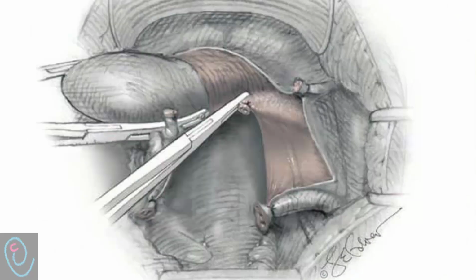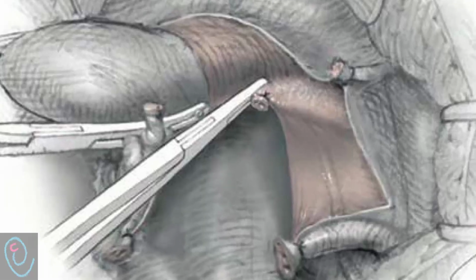Cardinal and uterosacral ligament transection. These ligaments are present lateral to the uterus and inferior to the uterine vessels. A straight clamp is positioned across the cardinal ligament, adjacent to the cervix, and medial to the uterine artery pedicle. A scalpel then transects the portion of the cardinal ligaments medial to the clamp. Ideally, the surgeon cuts close to the uterus. Then a transfixing stitch is placed below the clamp, and the clamp is removed as the knot is tied.